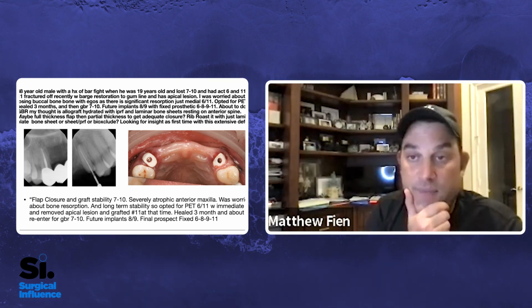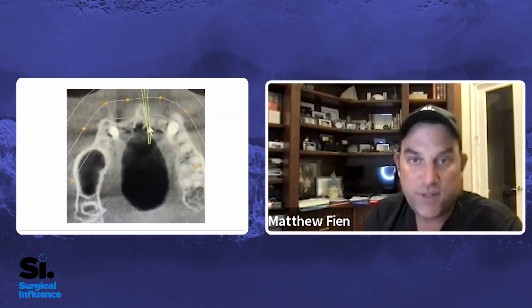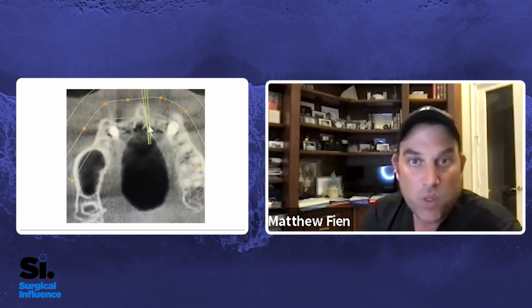which is something that, I think on these root canal teeth definitely takes some guts. But really the question that they were asking is, how do we treat this anterior defect? And you can see here, what's nice about it is it's not a vertical defect. It's a horizontal defect. And if you look, it almost looks very concave, really within the housing of the bone.